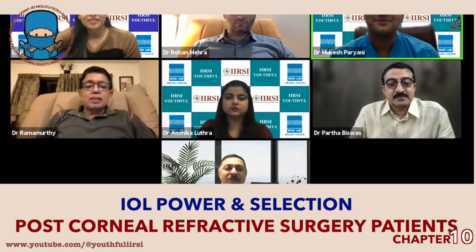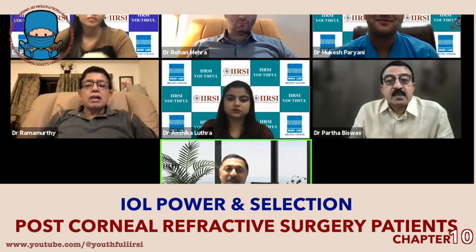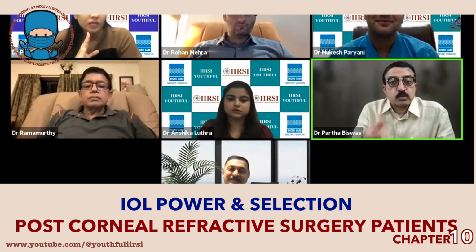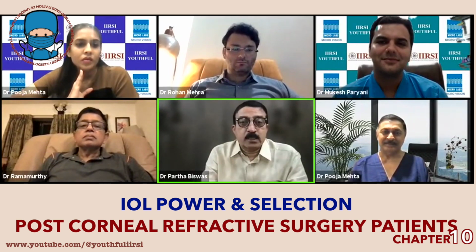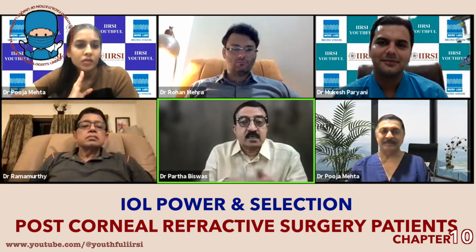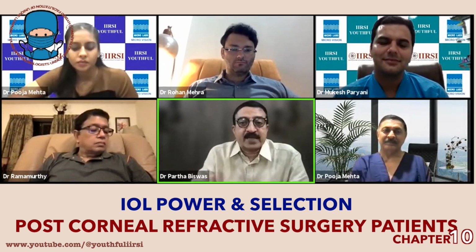Then how much do you fill up, Partha? Do you fill up with viscoelastic? Do you fill up with saline when you go in for your refraction by the optometrist? Yes. Initially, of course, the viscoelastic, methylcellulose, without any bubbles and optimally filled, not too hard, not too pressed. After removing it, it is the BSS which is filled, and then that final retinoscopy is done to ascertain that there is no apparent surprise.